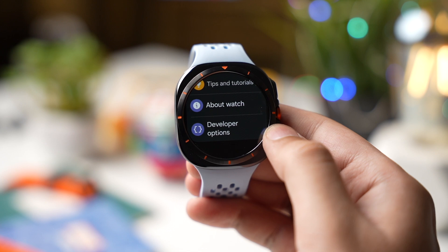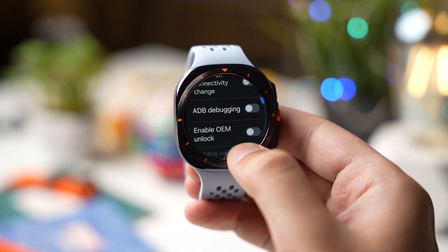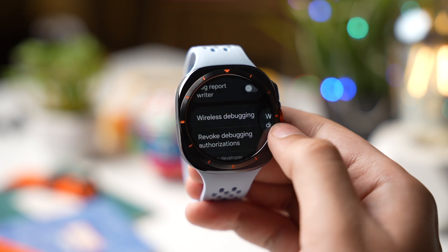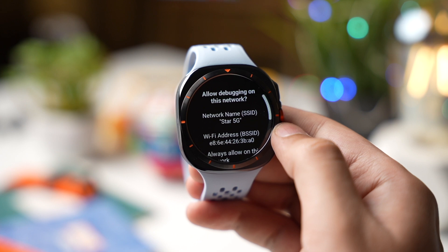Now go back and tap on Developer Options. Scroll down and choose Wireless Debugging, and turn this option on. If your watch shows a prompt message, just tap on Allow.